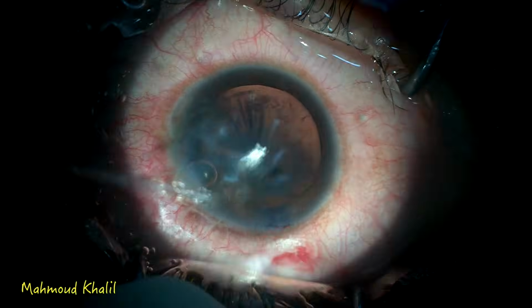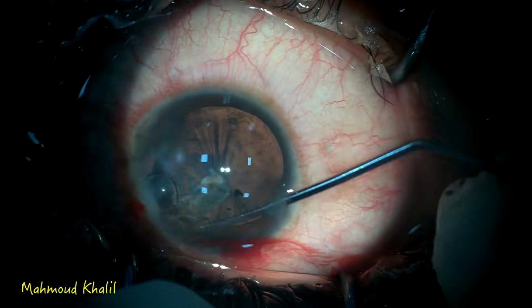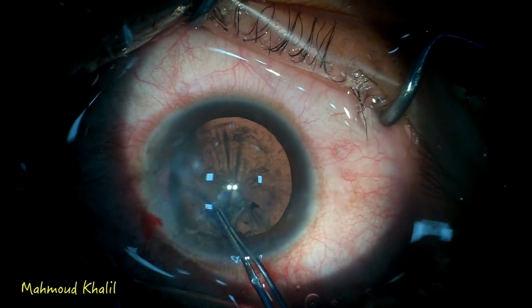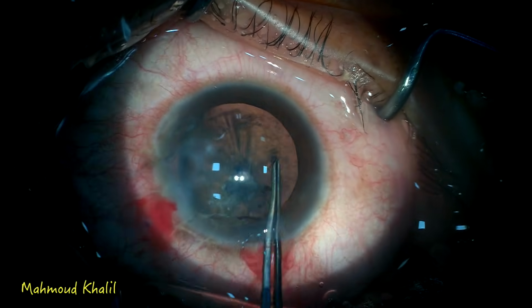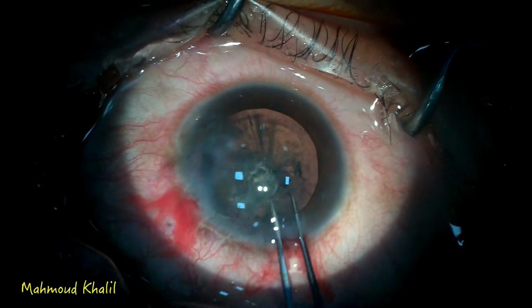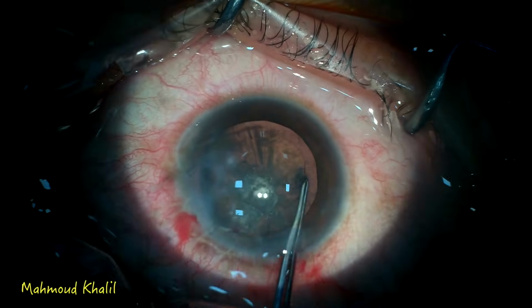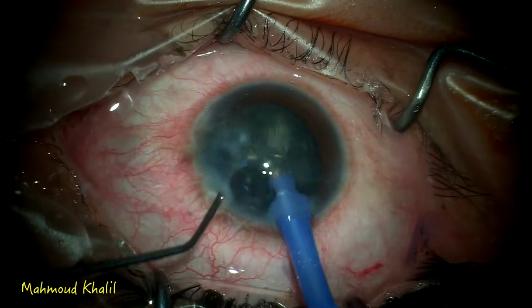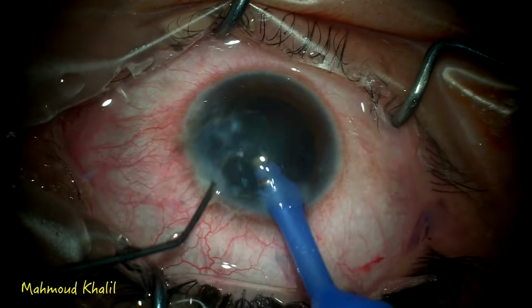Dealing with lens and iris injuries. Sometimes the lens is injured with subluxation or even an open capsule, and the iris also. As you see in this video, there is a corneal opacity at the site of injury, and this makes the visualization difficult. The capsule is corrugated and somewhat fibrous because the injury was at an old time. After doing a rhexis, it's hydrodelineation and hydrodissection, and then going for phaco.